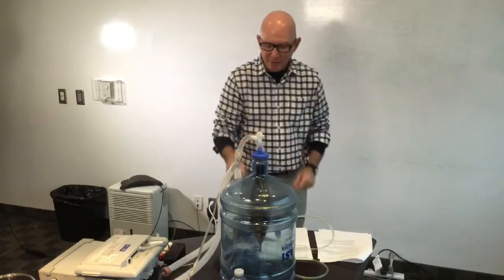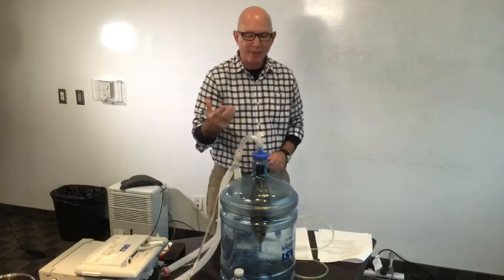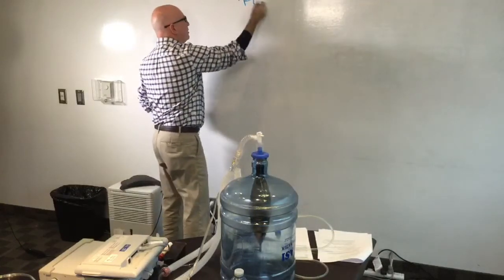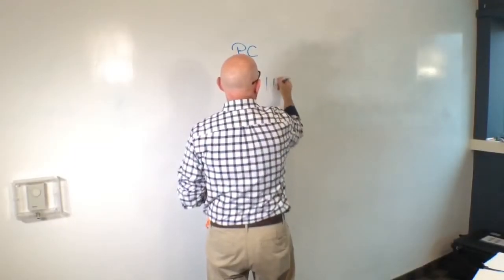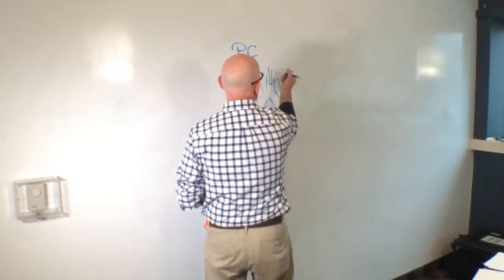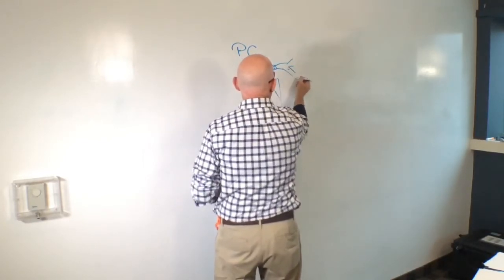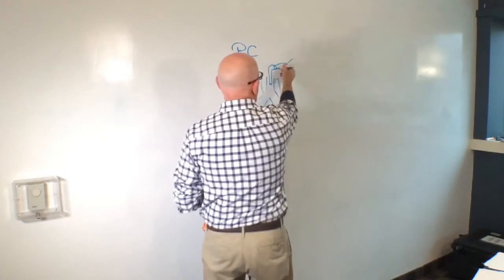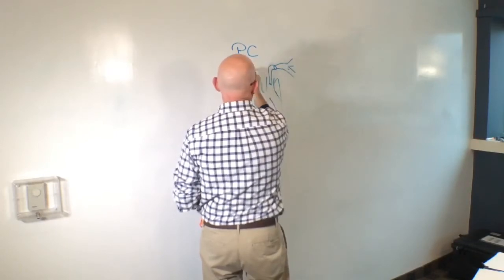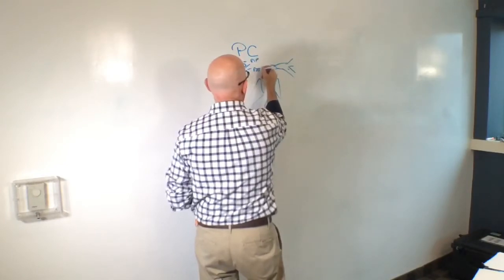When you consider what actually happens when you're ventilating somebody who has a leak with a machine like the LTV 1200, let's say your patient is in pressure control. The endotracheal tube is in place, and in this particular case it's a tracheostomy tube, so you have a ventilator circuit out here, and every time the ventilator cycles on, let's say you're hitting a pressure of 25 on 5, so 25 centimeters of water PIP and 5 centimeters of water PEEP.